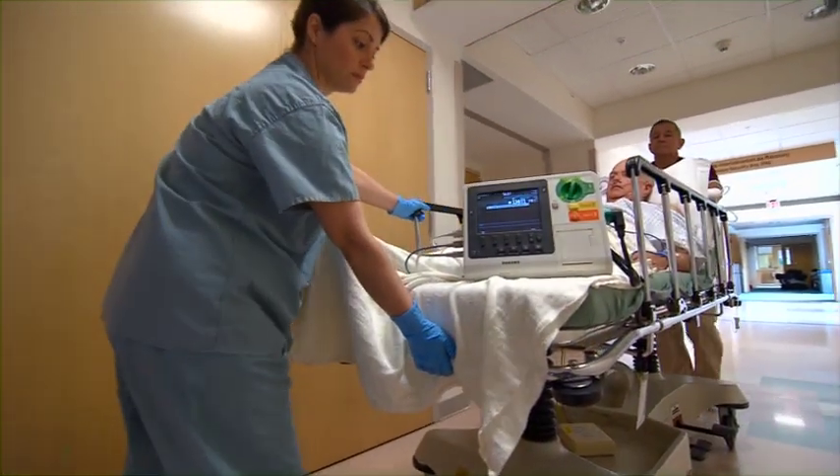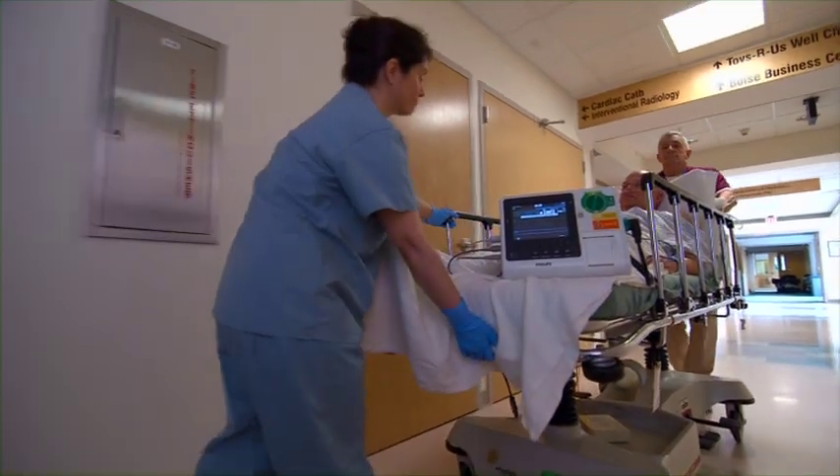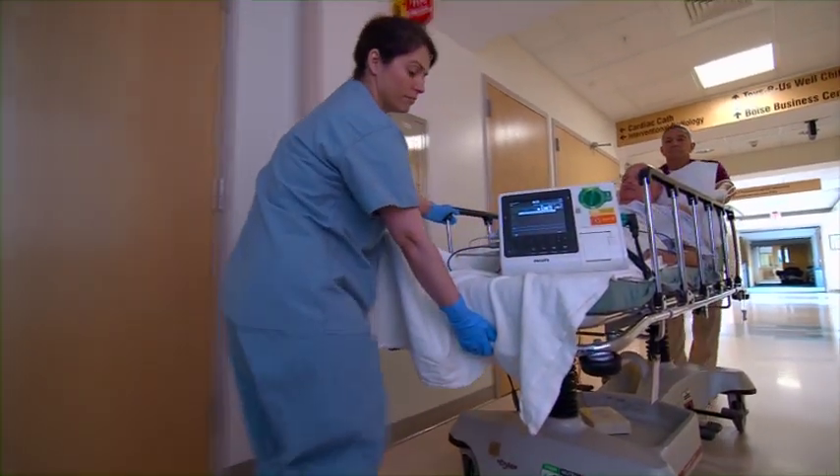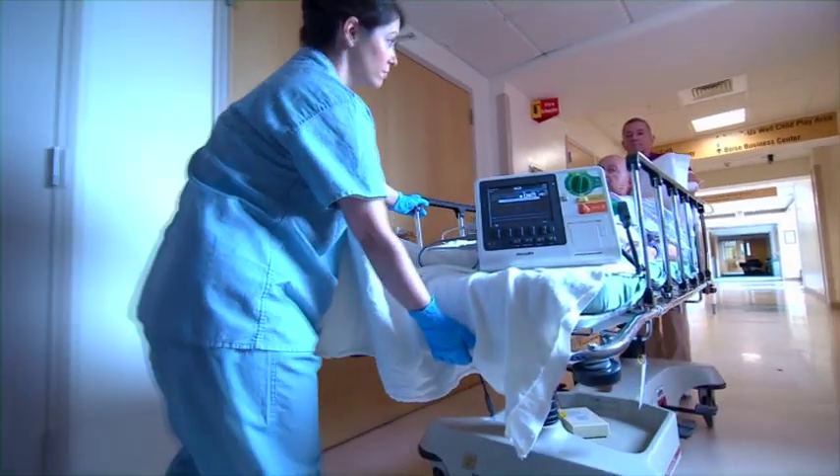The XL Plus automatically stores critical event data from all four modes for later transfer via a USB drive and download to Philips' data management solution, HeartStart Event Review Pro.